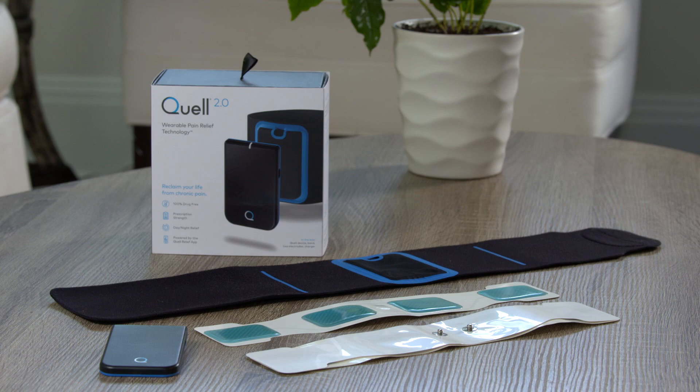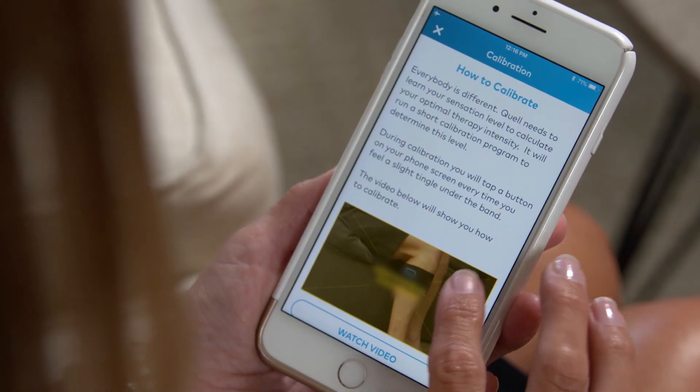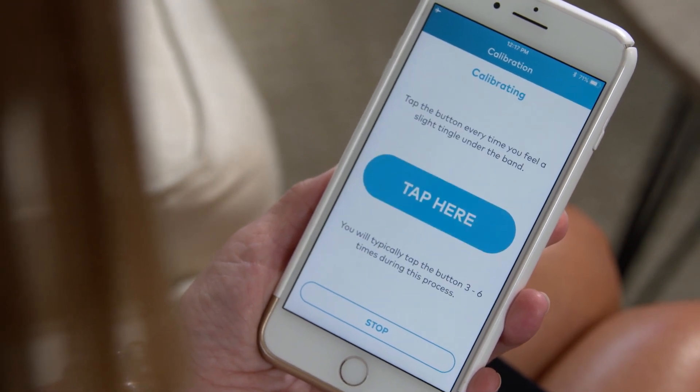This video will help you set up your Quell 2.0 and calibrate your device using the Quell Relief app. You must calibrate the device before using Quell for the first time. Calibration allows Quell to personalize your therapy intensity based on your sensation level.